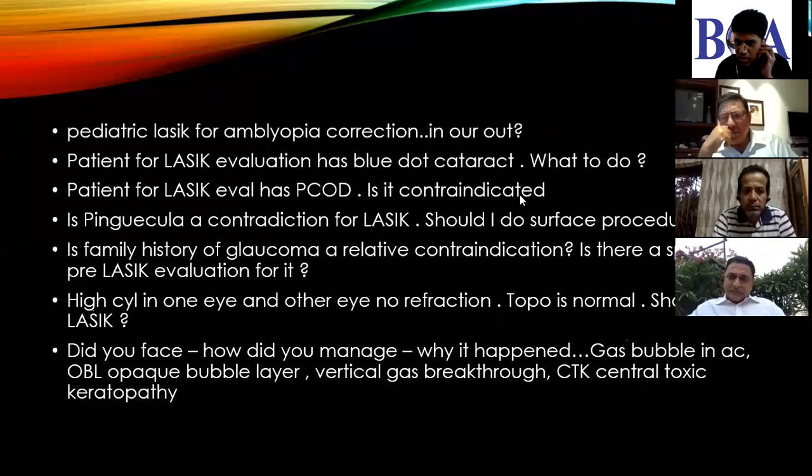Swapnesh, what is next? Side by side, there is a question from Dr. Kapoor: how soon can one retreat under correction? How soon do you take up the regression? Under correction, as we said, you diagnose it initially, and there's no need to wait. According to me, you can take it up. Absolutely, that's okay. You can take it up as soon as it's seen virtually. Okay, you can go to the next. But let me caveat that.